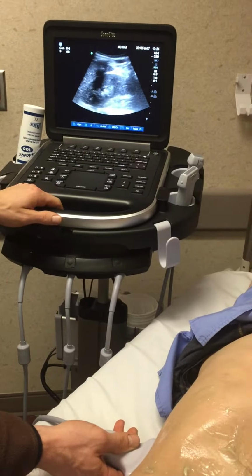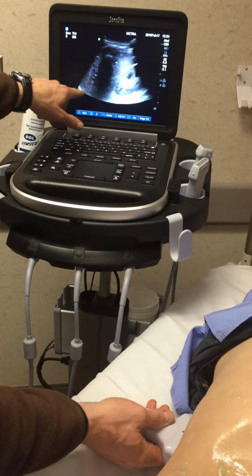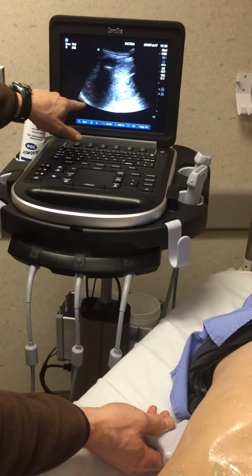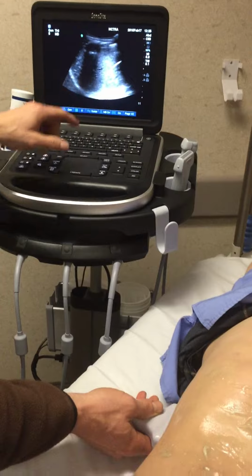If you want to extend the FAST and look for fluid in the thorax, you can see I'm sliding upwards towards the lung. And there's the diaphragm there, and you don't see a black line in the lung field. Also you see a mirror image, so this is normal. The liver looks similar, like it's in the lung.